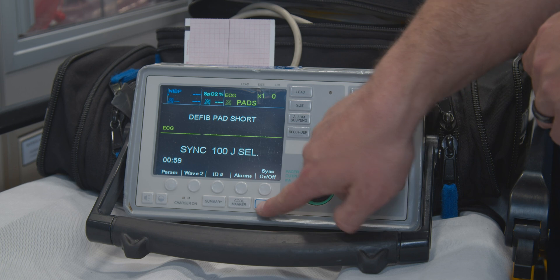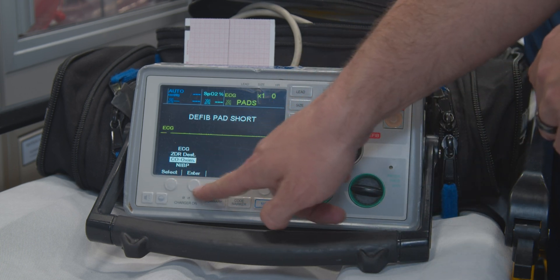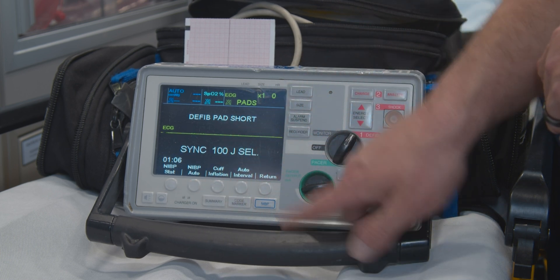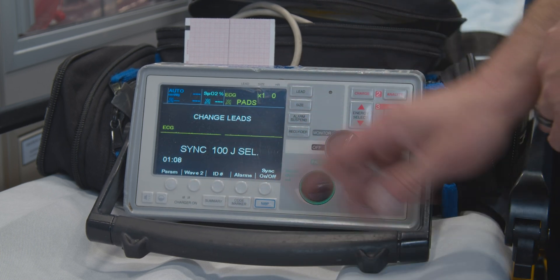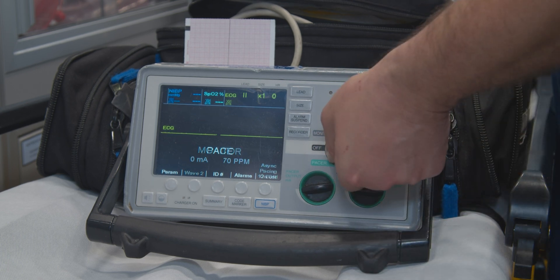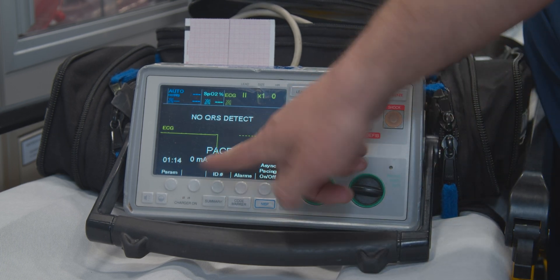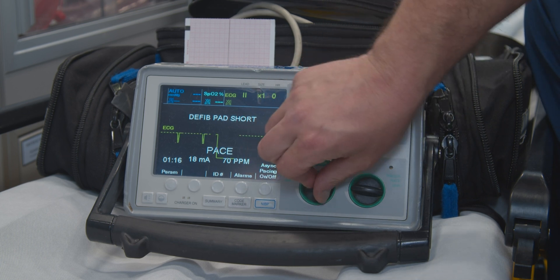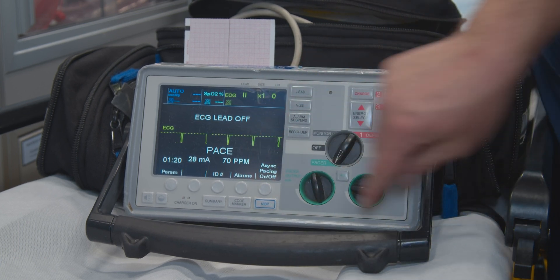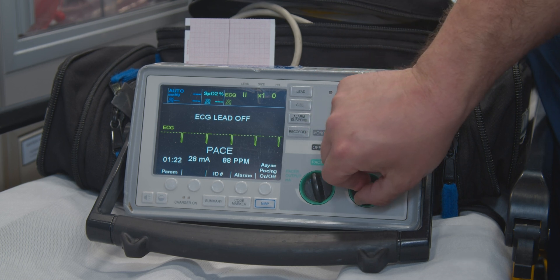I'm going to go ahead and turn it off. Now we've got that taken care of. You want to go to pacer — down over here, pace. You can change your amperage, go back down. You can change your rate to 100 if you need to.